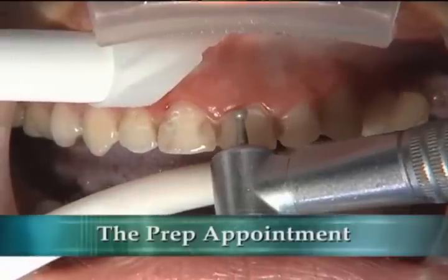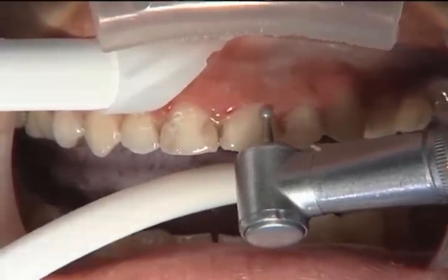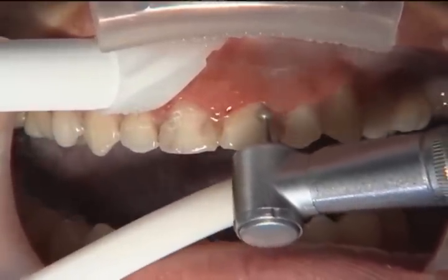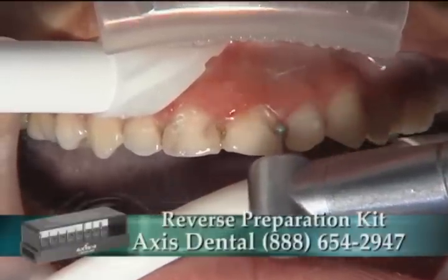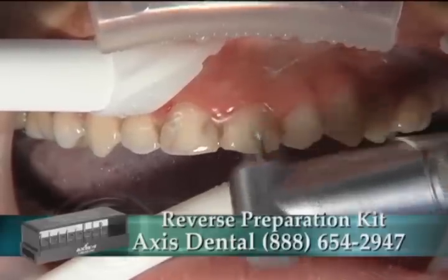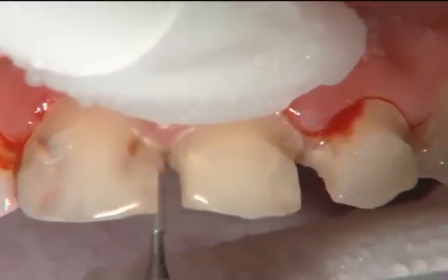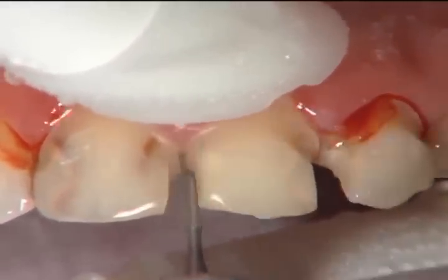As the first step in the reverse preparation technique, we're using a round burr — the 801-021 from Axis Dental. All the burrs in this presentation are from the reverse preparation kit, also available from Axis Dental. We're going in and breaking some interproximal contacts. Normally I really emphasize having no bleeding during preparation, but on this patient we're going to use the laser to adjust some gingival levels.